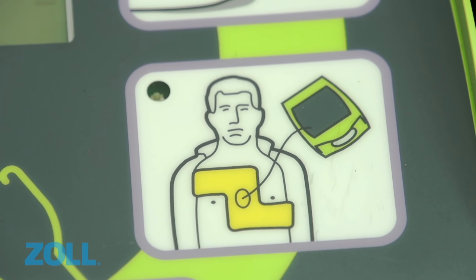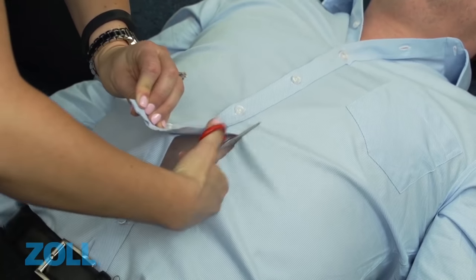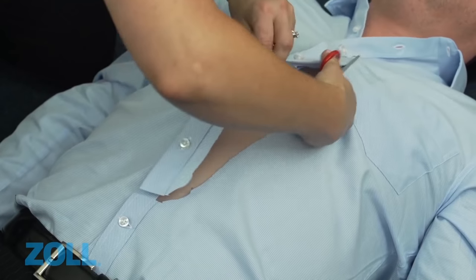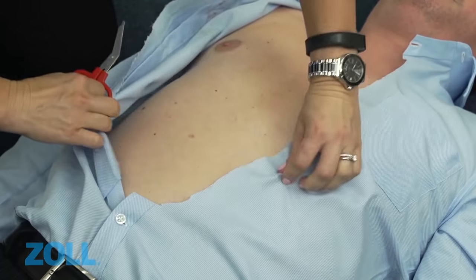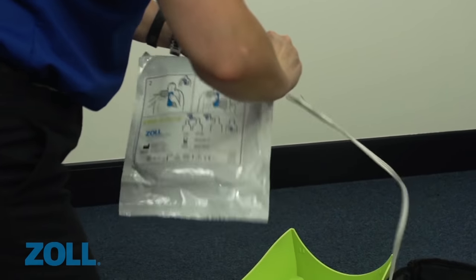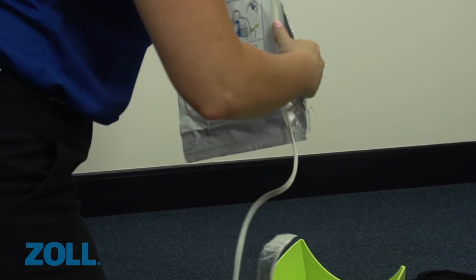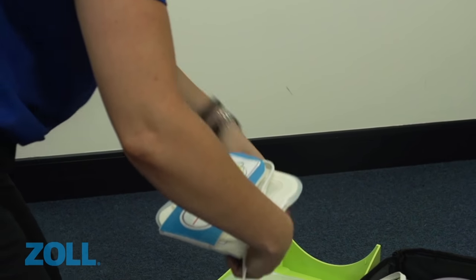Attach defib pads to patient's bare chest. Use the scissors from the ready kit to cut the victim's clothing to expose their bare chest. Tear open the electrode pack and unfold the electrode pads. The CPR-D pads are one-piece pads that are easy to place.